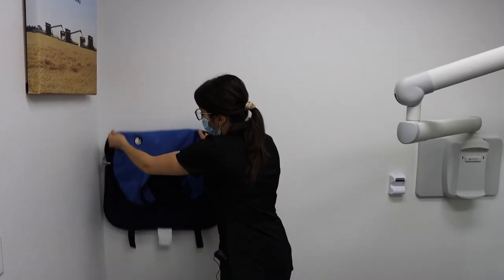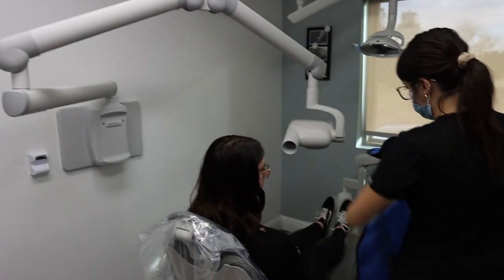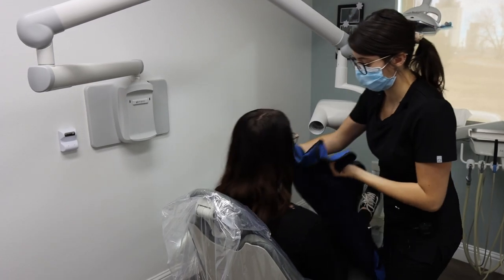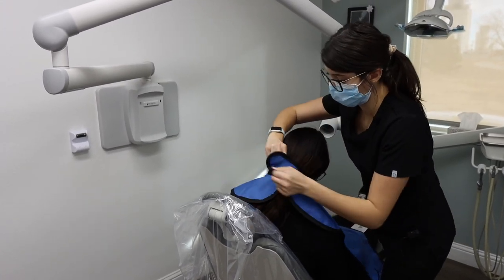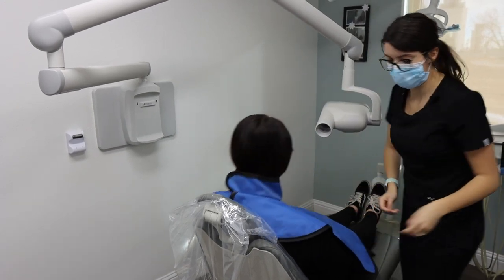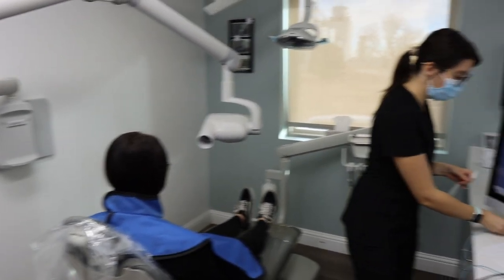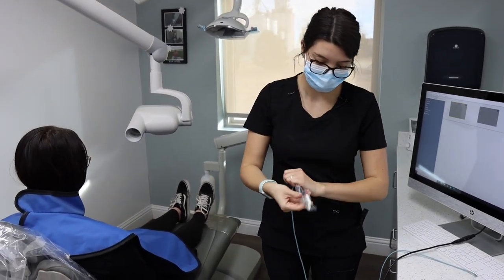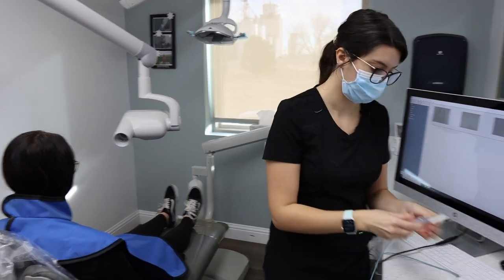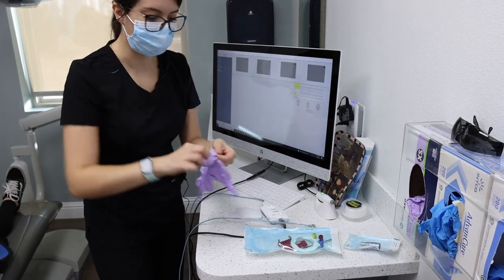You're going to place the poncho on the patient, ensuring to cover the neck and thyroid. You're then going to place a barrier on the sensor, and at this point you will put gloves on.